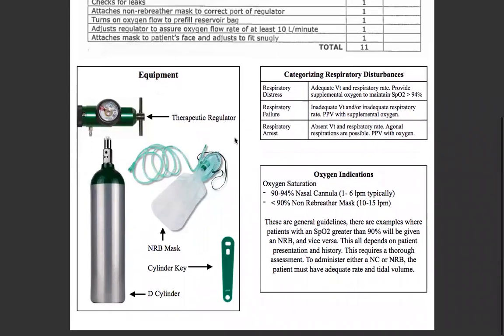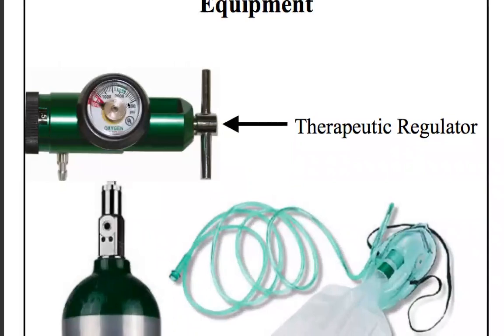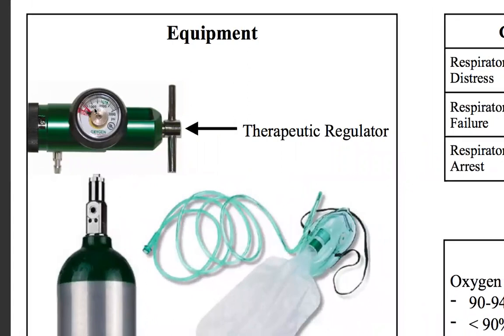This is the therapeutic regulator up here. You can see the dial that shows you the PSI — full would be 2,000, and we typically switch them out when they drop below 1,000. This is where you will select the flow rate: typically for nasal cannula that's going to be anywhere from 1 to 6, and for non-breather mask that's going to be 10 to 15.